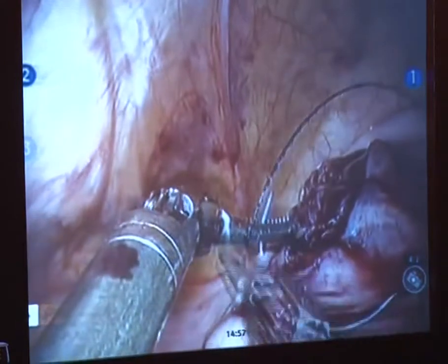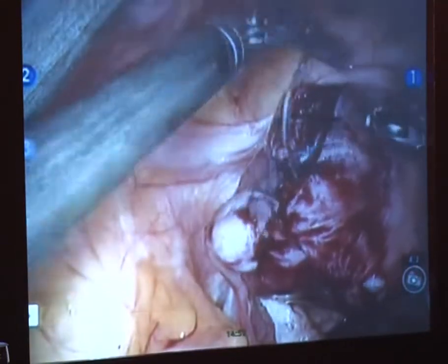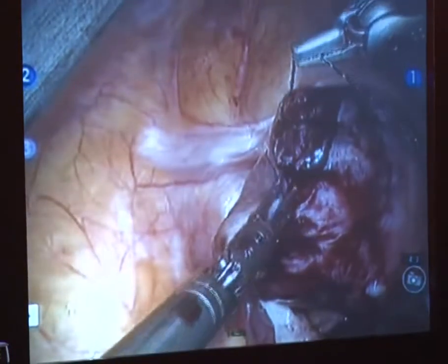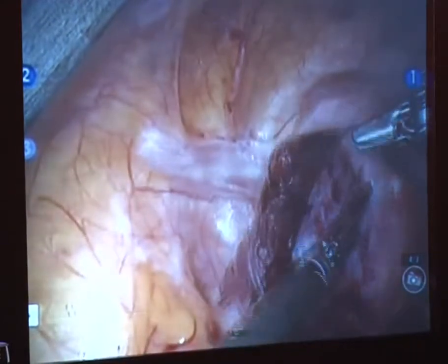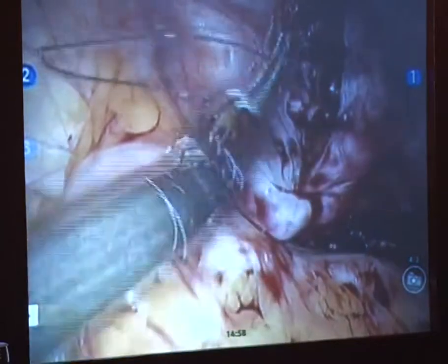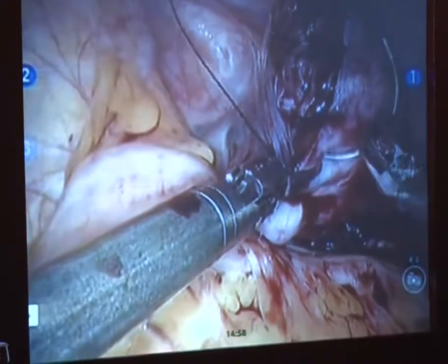She had a little bit of redundancy in the serosa and the muscle here, but I don't like to trim that, because the uterus will remodel over the next couple of months. And this way we don't end up taking good functional muscle. Here. I'm just going full thickness. This is now full thickness of serosa and muscle.